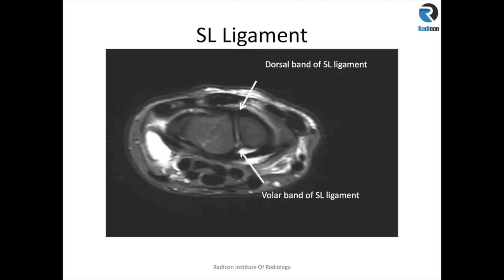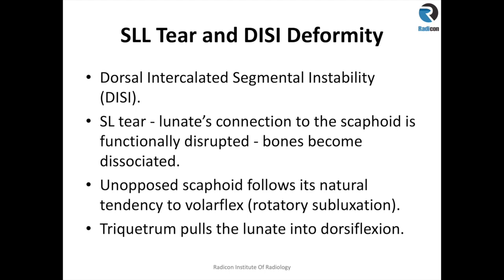Here is an axial view of the scapholunate ligament. The dorsal band can be seen between the scaphoid and lunate, and that is the volar band of the scapholunate ligament. As mentioned earlier, the dorsal band is the thickest part and the volar band is the weaker part of the scapholunate ligament.